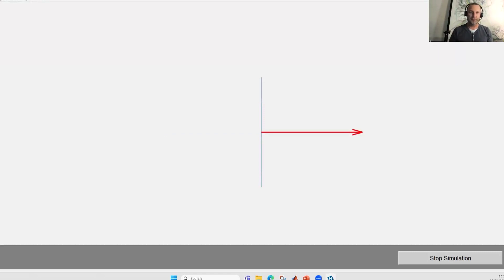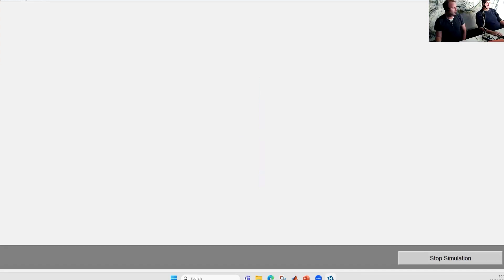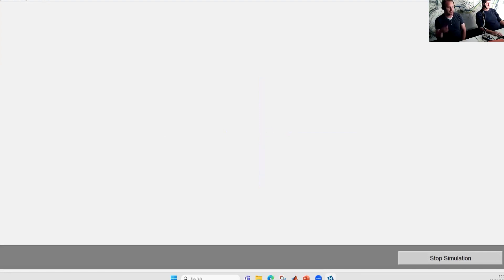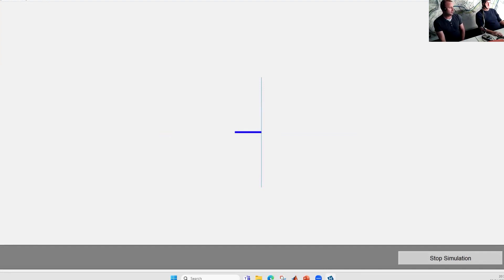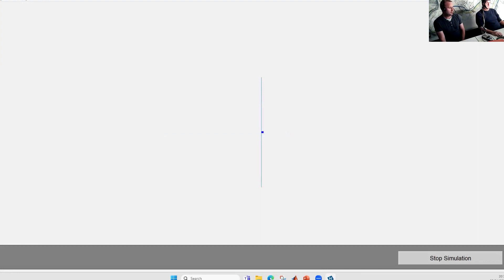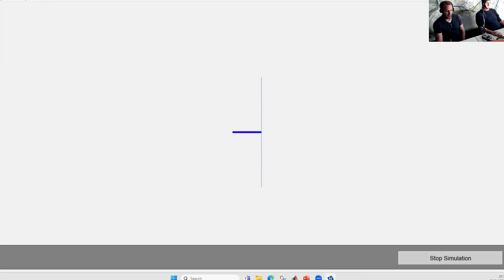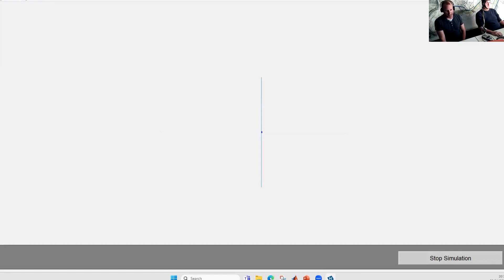I switch my camera so you can see that really. Now left-hand side again — we get feedback. You can see sometimes it's a bit on the wrong side at the beginning, but when it's detecting correctly, we get the stimulation. Now left arm is detected and it's moving. He had quite good accuracy — almost around 90%, or between 85 and 90%, which is quite good for good control. Everything higher than 80% is already good. Otherwise, if you have a low one, it's maybe a little bit frustrating if it's not stimulating.